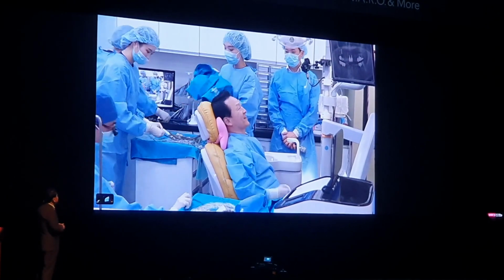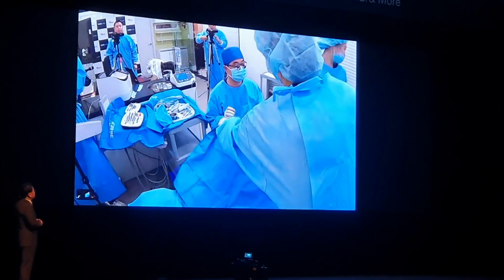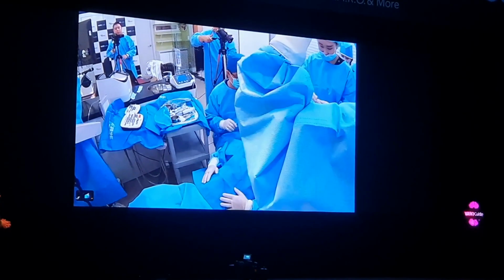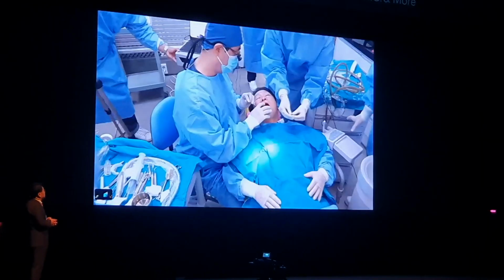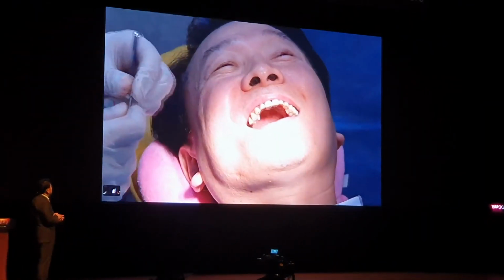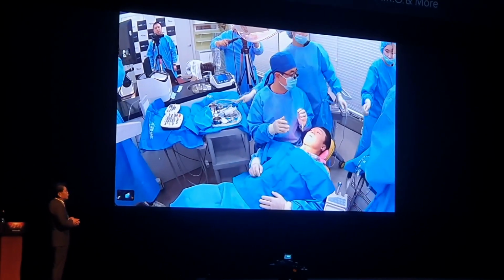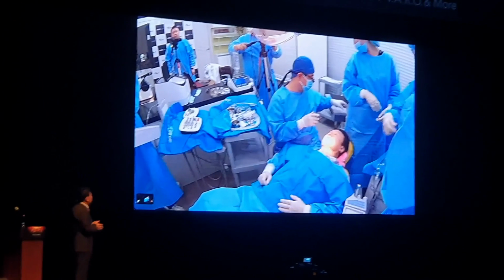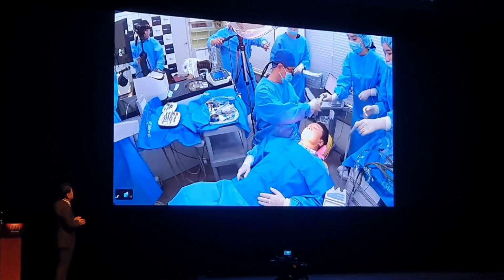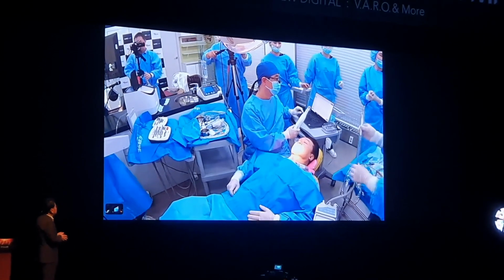So we'll go ahead and use the intraoral scanning. Yes, you would like to say that. So please give me the scanner, please. So we can prepare the planning of the restoration once we connect the encoded healing abutment and scan the area. Wow, I've just noticed that Dr. Ho's mandibular teeth are mostly gold crowns. Most of them? Air, please. As you all know, gold crowns are not easy to scan. I'm changing the sterilized tip. Yeah, the tip of the scanner is replaced.